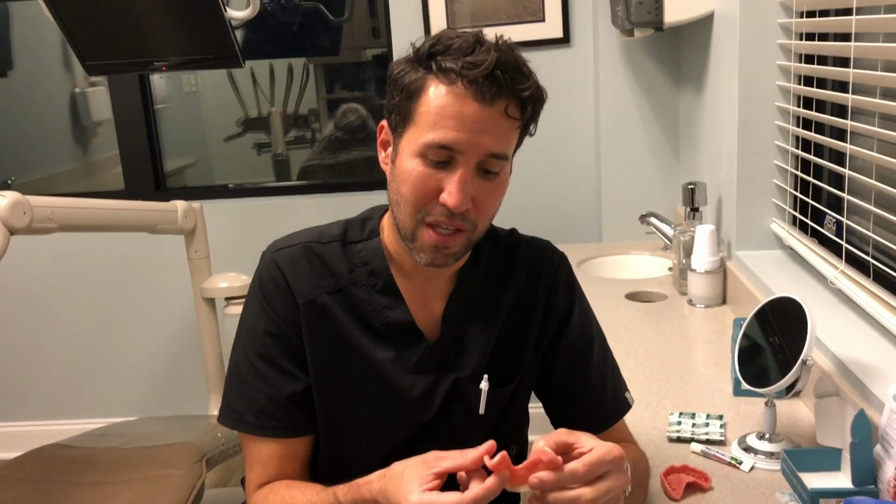Hot water, back in your mouth, size it in, and if you don't like it, drop it back in the hot water and do it again. It will completely reset the material, allowing you the opportunity to get it flexible again, shape it up again, and you can do that as many times, up to 20 times. So you really can't mess it up. If you don't get it right the first time, don't get frustrated, put it in hot water and do it again.